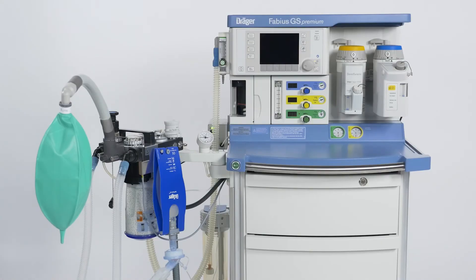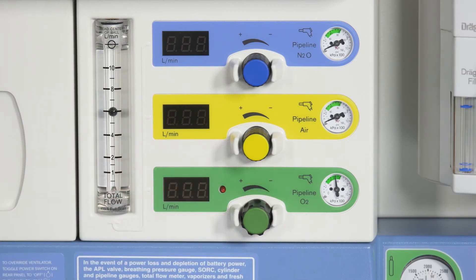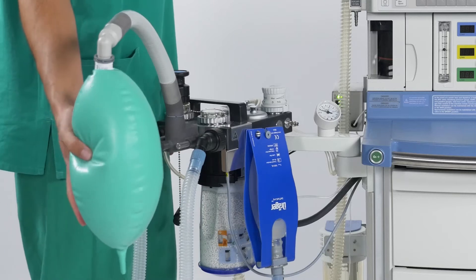In this part, we'd like to explain the anesthesia machine behavior in case of an emergency start. If the Fabius GS Premium is switched off completely and you need immediate access to ventilation, the only thing you need to do is to turn on the oxygen flow. The fresh gas is now directed to the breathing system and you can manually ventilate the patient using the APL valve — short for adjustable pressure limitation valve — and the breathing bag.